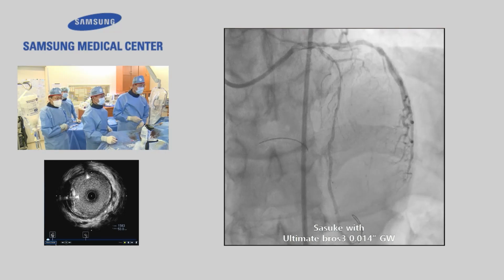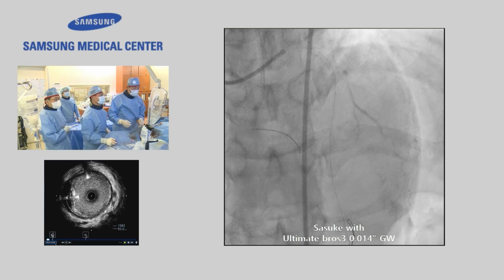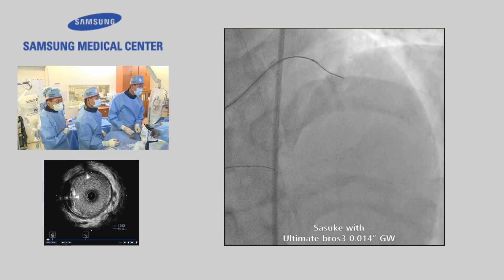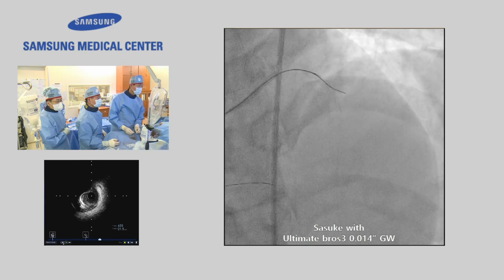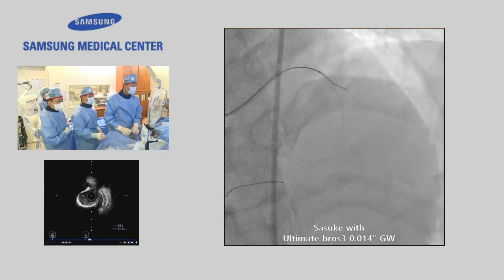Okay. Stop. Okay, we are almost there, but I'm not sure this is inside the plaque or we need to go down, right? About 7 o'clock. No, 5 o'clock. I should be very careful at this point.